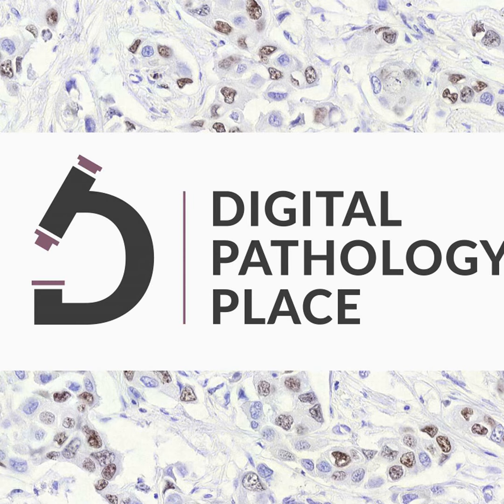If you're interested in using it, I think you could probably install it yourself, and it will work on, for example, a laptop. You don't need any type of very sophisticated computer. You should be able to run it just by going to the command line and typing the command shown in the documentation. It really should be that easy. For pure pathologists that are not very technically heavy, it might be a little bit too much, but there's 100% of the time people within their organization that are capable of doing it. The technical skills needed are really just slightly above introductory.